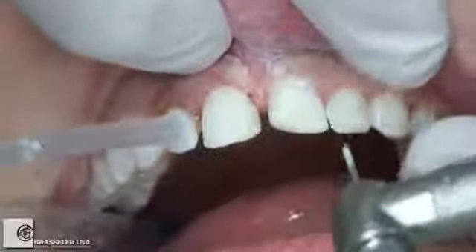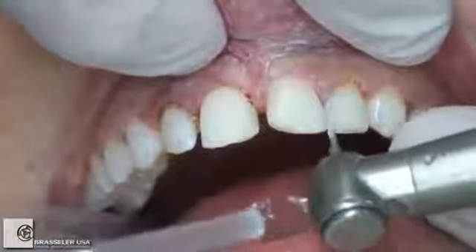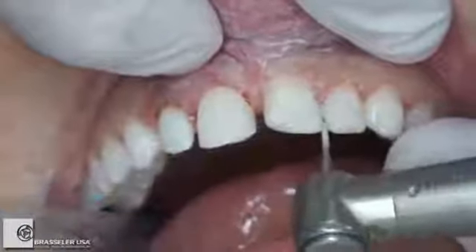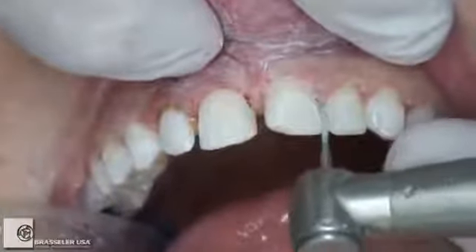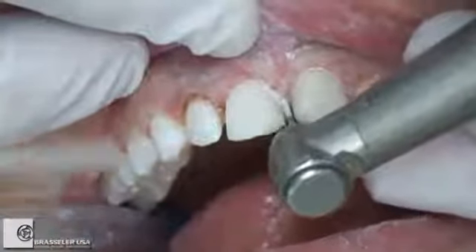And I'm just going along and putting a little light chamfer finish line on that, toward the distal right there. We're not widening the tooth. We're going to narrow the tooth just a little bit there. So I'm going to remove a little bit more tooth structure on the distal line angle of that central incisor.